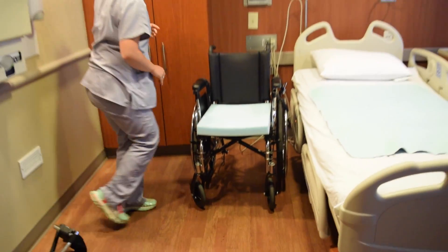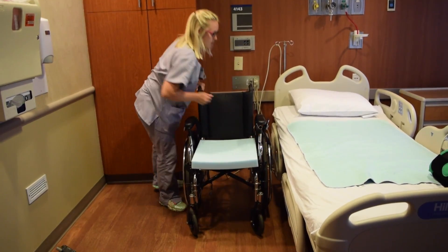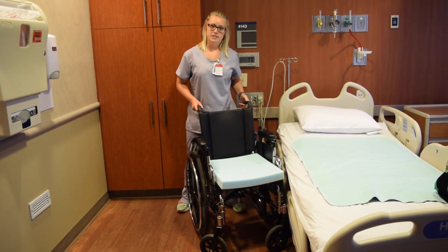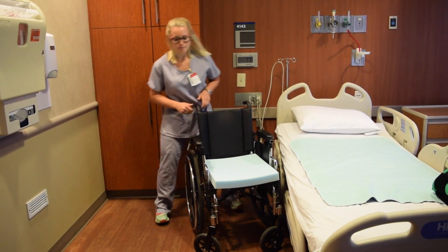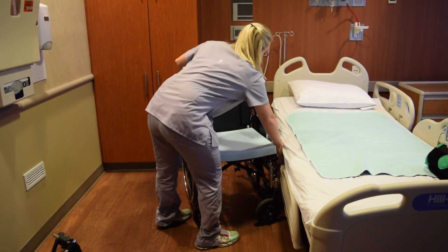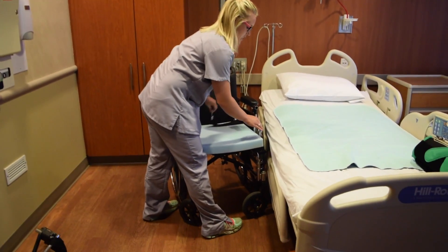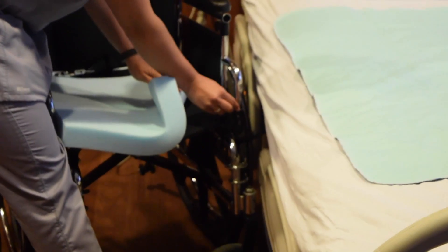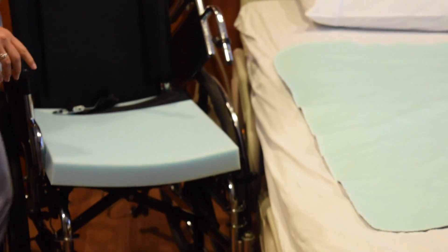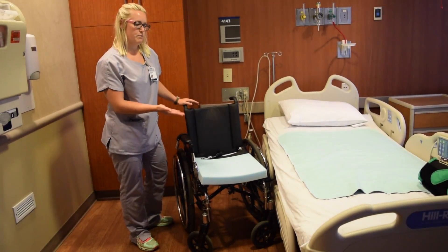You then want to position your wheelchair close to the bed so that it's either right up against the bed or on an angle, depending on the type of transfer you're doing. You then want to lock your brakes to ensure patient safety, and you can remove an armrest to make the transfer a little bit easier. To do this, you pull back on the knob in front and simply lift the armrest to move it out of the way. Your wheelchair is then set for a patient transfer.